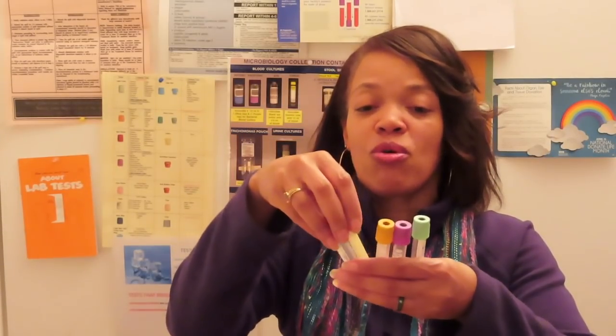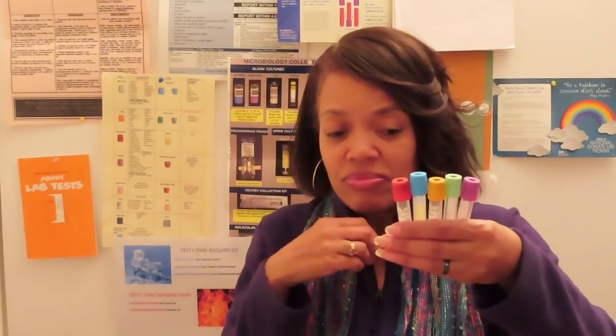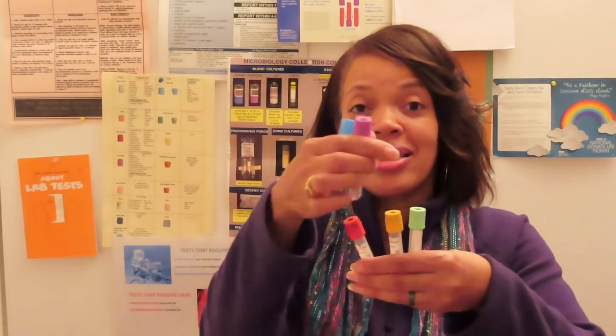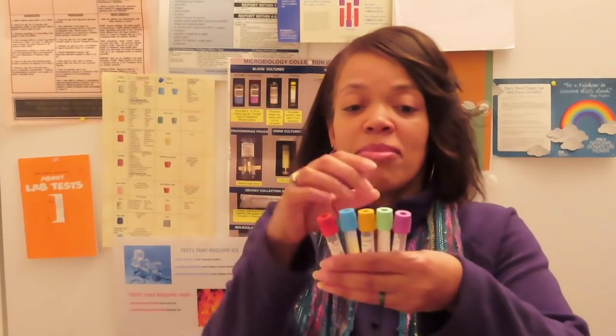You must go back to the basics when you get out of school and start getting all these other tubes involved. Please remember your basic tubes. I have a slew of tubes here, but these are the tubes you will actually get in your flat box. There are five basic tubes you should become familiar with, and these are going to help you with your order of draw — because when you add other tubes, you'll be familiar with what's in them, especially your EDTA tubes and your buffered sodium citrate tube.